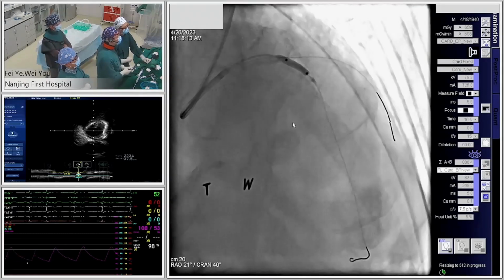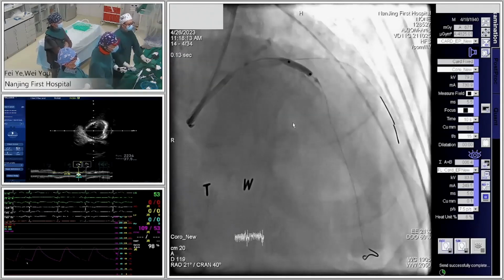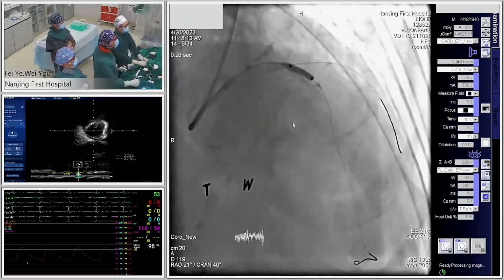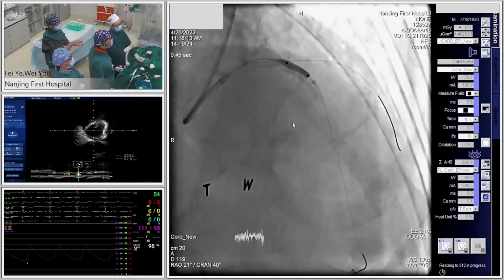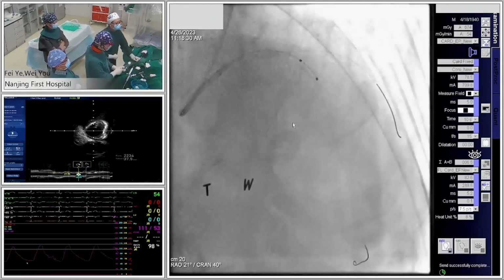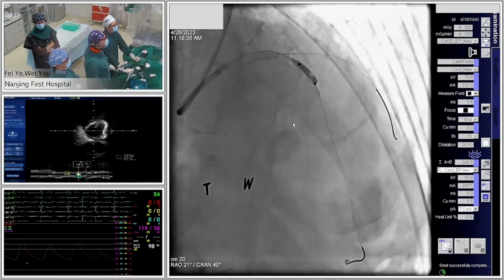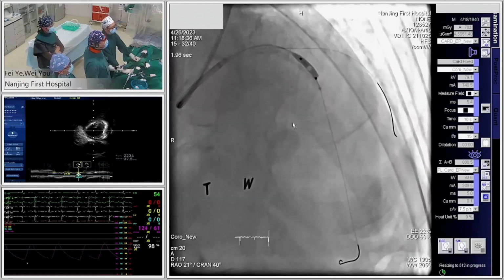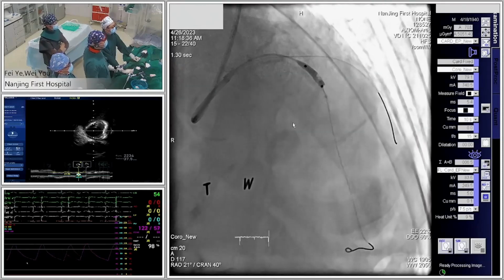So today we will perform a DK crush to treat this lesion. But before stenting, we should prepare the lesion well. One is the LAD, a little distally. Just because the middle part of the LAD reference diameter is 3.0. Is that right? Yes. So we use a 3.0, 1:1 shockwave balloon, 1:1 size, to prepare the lesion.